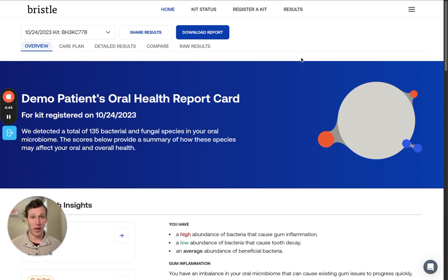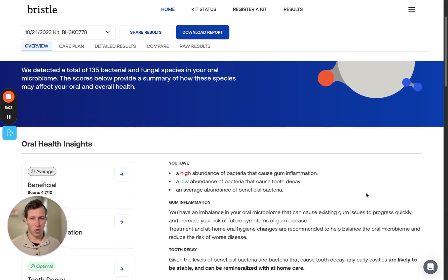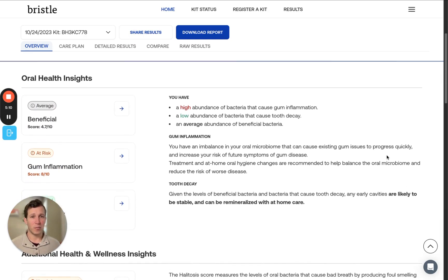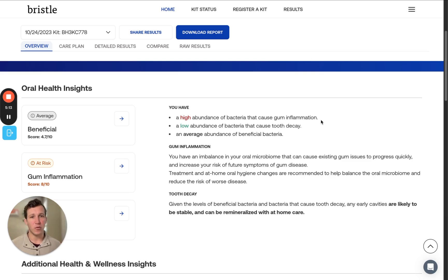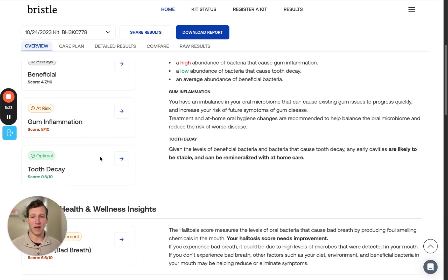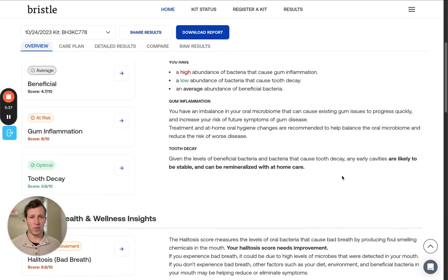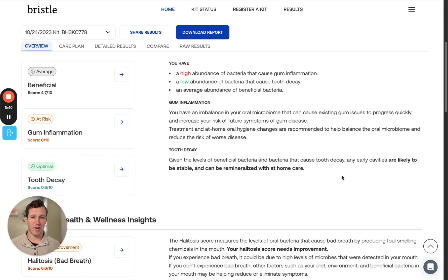So now we're going to go over the oral health report card. The report card provides a summary of your test results, allowing you to quickly understand your oral microbiome's health. Each score, as we see on the left, includes a few pieces of information. First, it'll be the insight — which condition we're reporting on. In this case, we're measuring the abundance of bacteria associated with gum inflammation, beneficial bacteria, and tooth decay. You'll see that each score ranges from 0 to 10, which reflects the abundance of bacteria related to a given condition, with 10 being the highest. The higher the score, the more bacteria you have associated with that score.